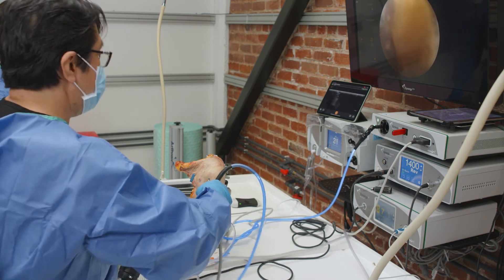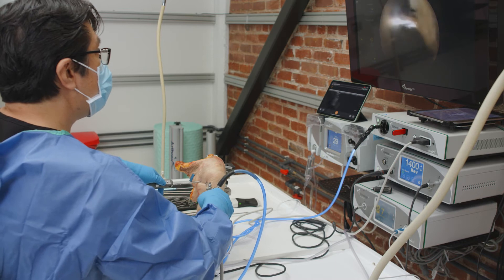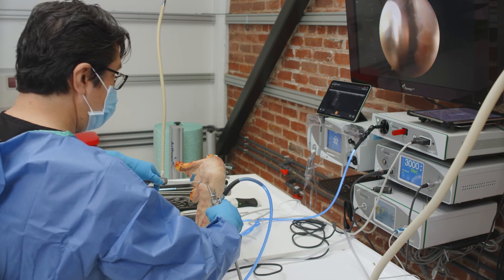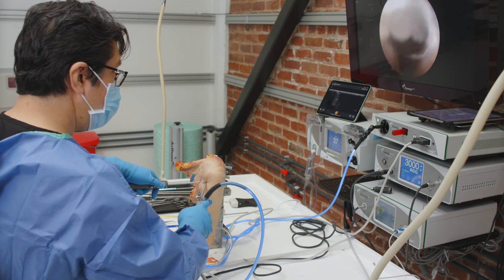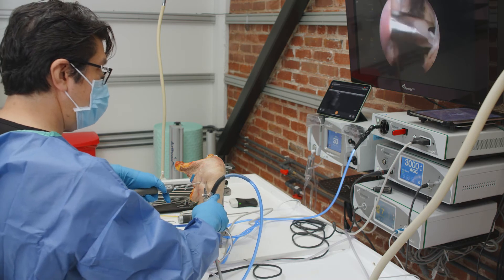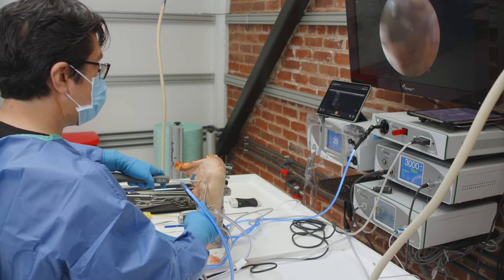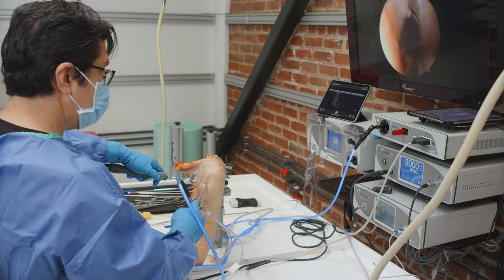You can see it pretty easily, pretty quickly right there. I'm going to go ahead and clear out the area of some soft tissue, and we should fall right on the biceps — right there. There it is. You can see the biceps instantly. There's no guessing, no uncertainty about where I am or where I need to be. Here's your biceps.